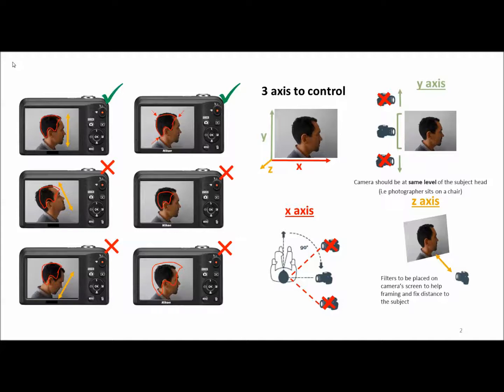Here are some tips for taking the best quality pictures. First, the patient should be looking straight forward. Selecting a reference allowing to keep the head in the right position, like a switch on the wall, can be of help. Make sure the grid fits correctly to the image and it's not too small or too big.